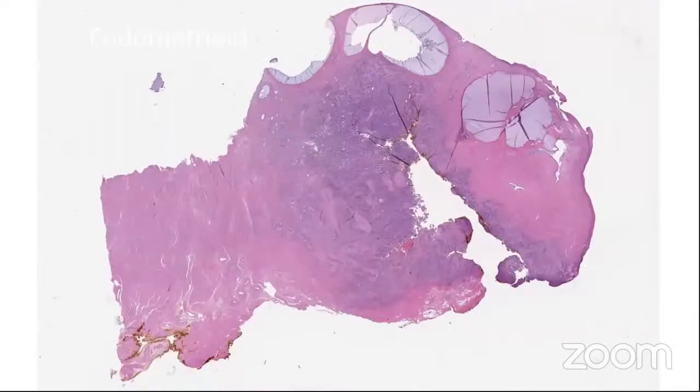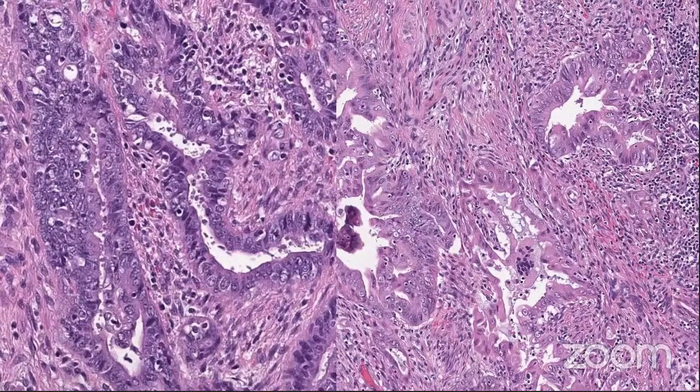Here's an example of an endometrioid carcinoma, and you can see that it's deeply placed, present at the deep margin, and does not involve the overlying mucosa. Though we didn't see endometriosis in this particular case, it's probably where this tumor arose from. And if you look at it on high power, it looks just like endometrioid carcinomas of the corpus or the ovary. You can even see some tumor infiltrating lymphocytes and a MELF-like pattern here.